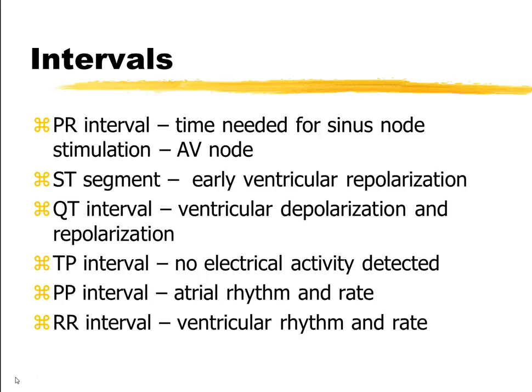Now, intervals. These are really important when we start talking about different types of dysrhythmias because the intervals get longer, shorter, or mixed up. So the PR interval, this is where the atria have a brief pause before that ventricular activity can happen, before that AV node gets the message.